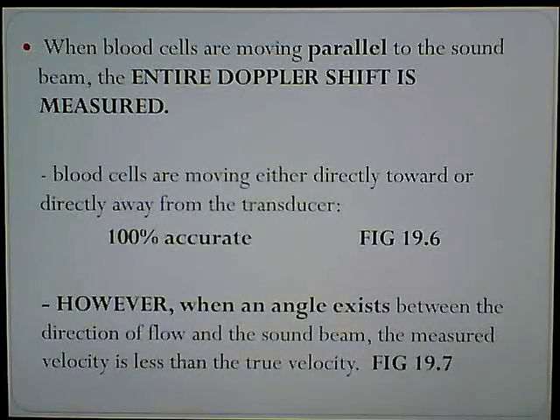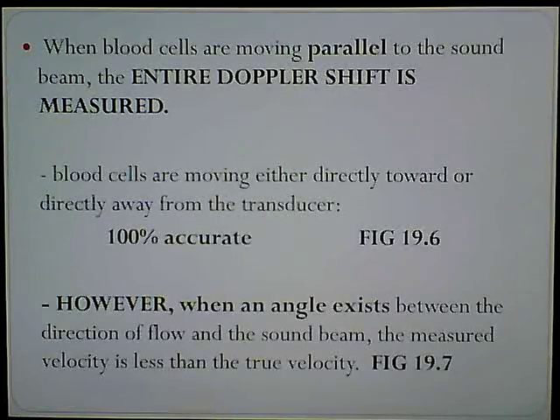However, when an angle exists between direction of flow and the sound beam, the measured velocity is less than the true velocity.